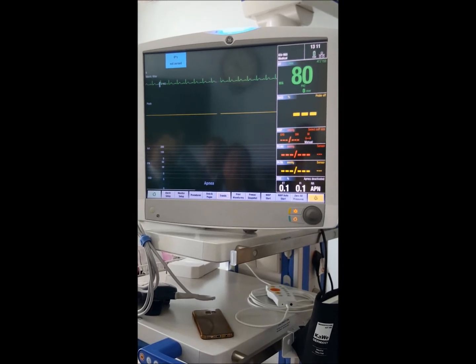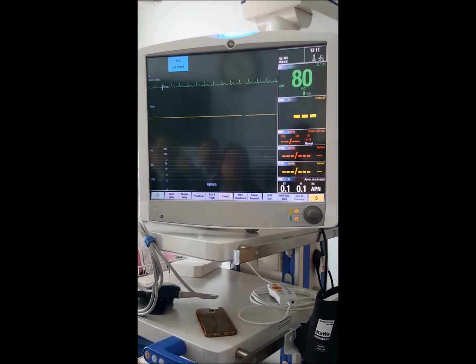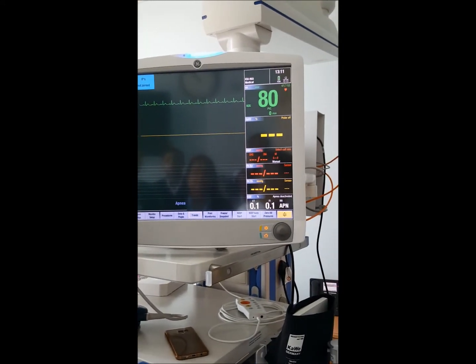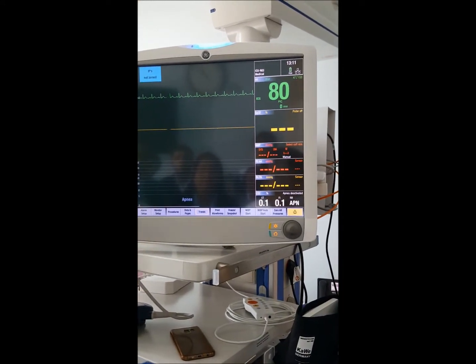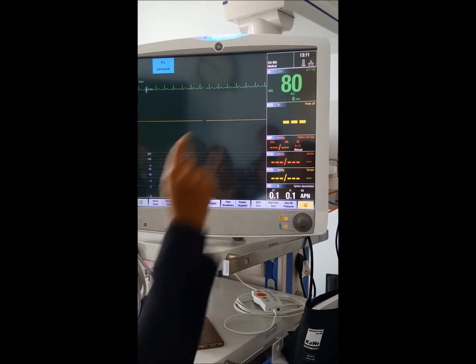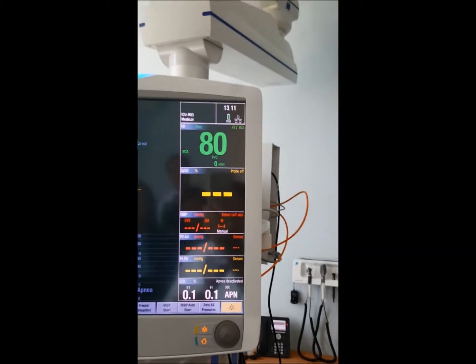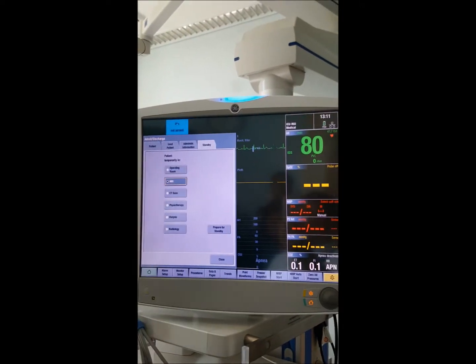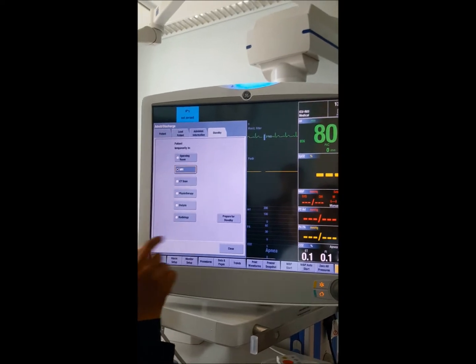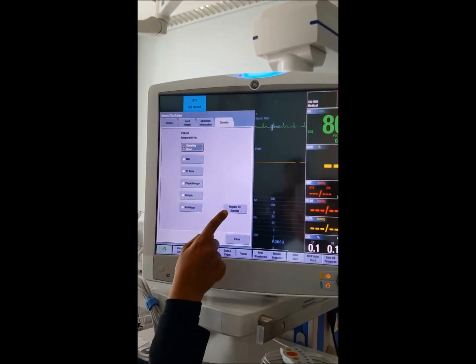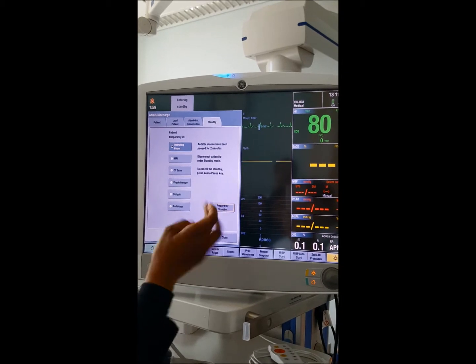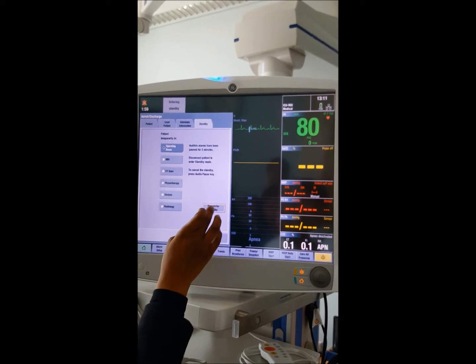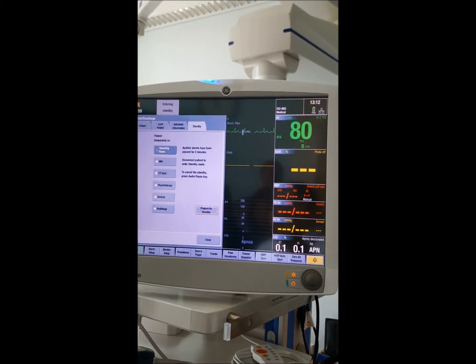One last thing: how to put the monitor in standby. If the patient is going for an MRI or CT scan, there is no need to discharge or switch off the monitor. Click the box, press standby, and indicate where the patient is going — for example, MRI or operating room.